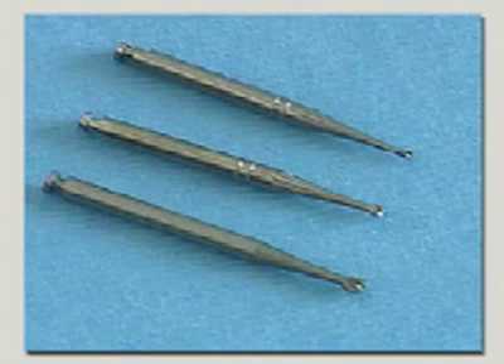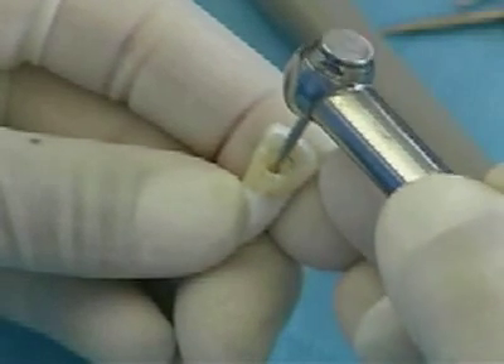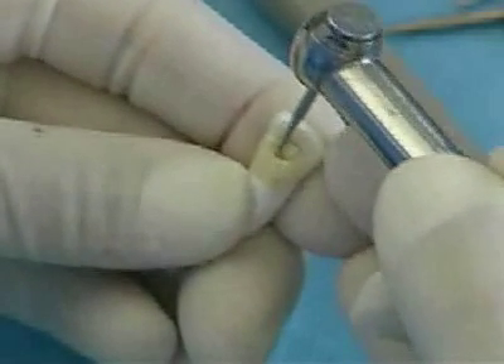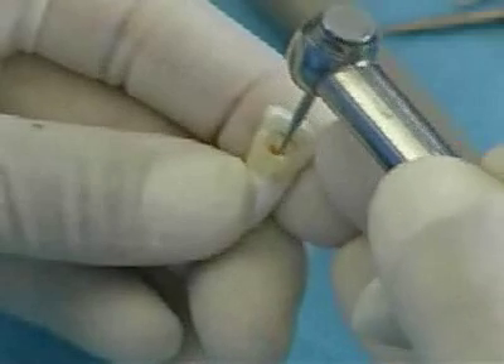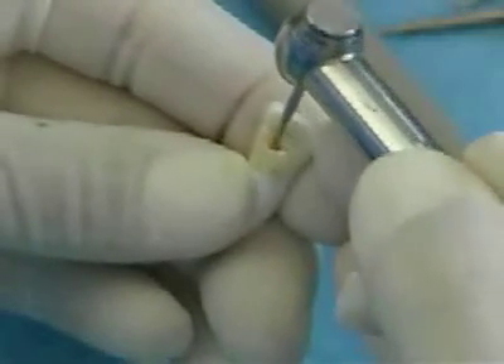With a low-speed long shank number 4 or number 6 burr, depending on the size of the pulp chamber, make a cut with the long axis of the tooth and cut directly through the dentin into the large pulp horn or the largest area of the pulp chamber. The burr should be used with a pull stroke from the chamber and out.